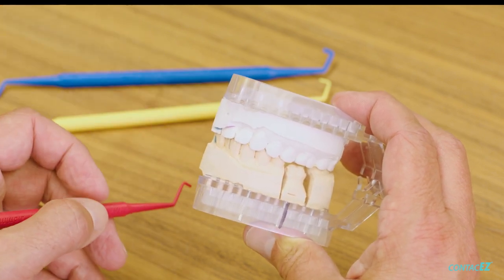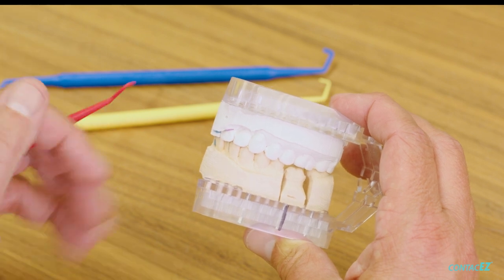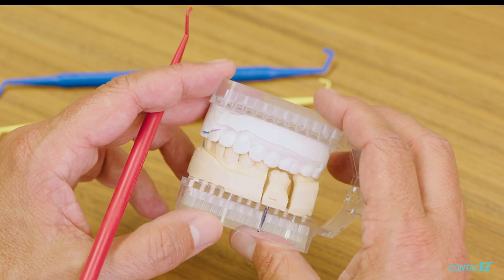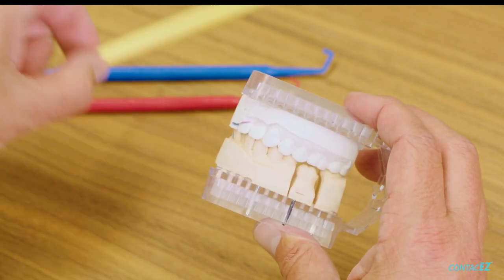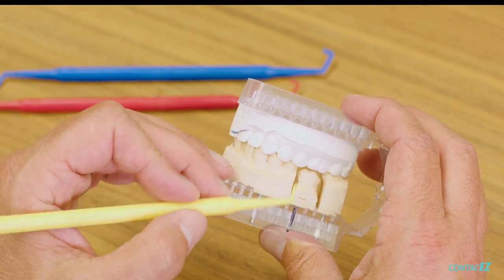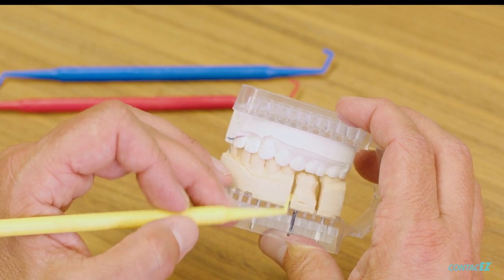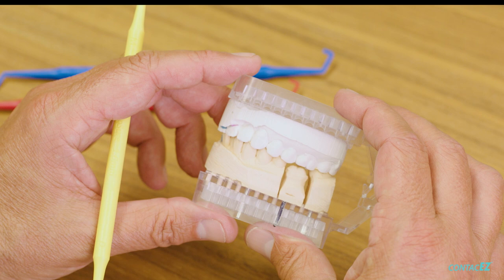This is typically what you'll see — different reduction on each of the cusps. What we're trying to do is make sure that whichever cusp is the most minimally reduced, it meets the minimum material thickness for whatever material we want to use. Since the one millimeter PrepSure was clear on all four cusps, if we're doing a solid zirconia crown or even lithium disilicate, we're plenty thick for both of those crowns.